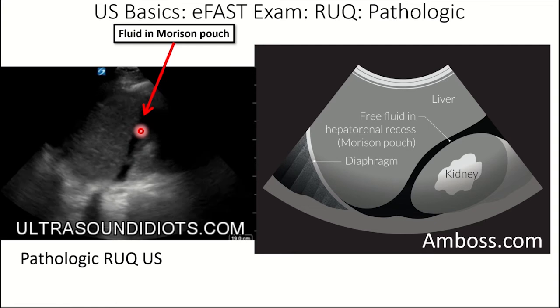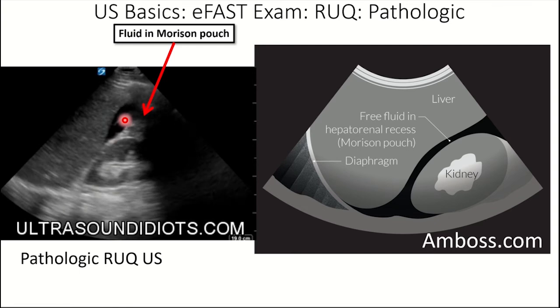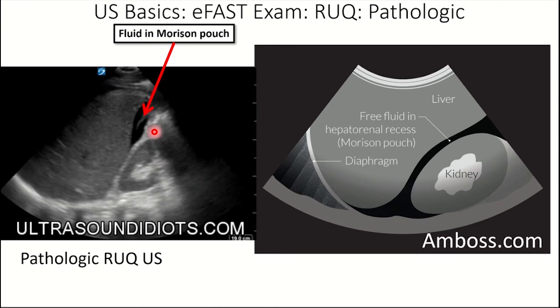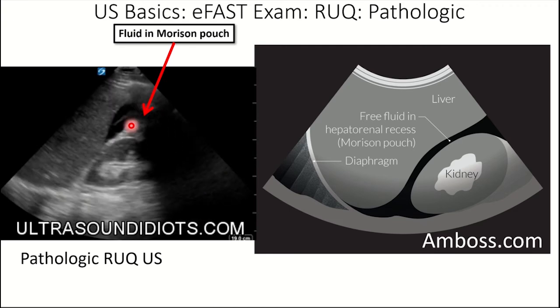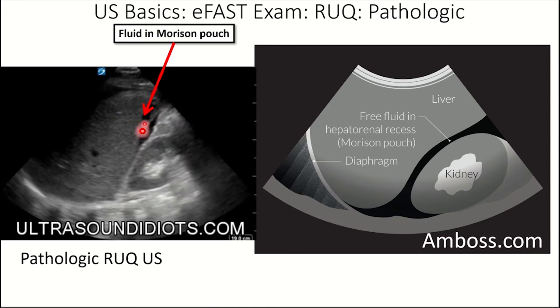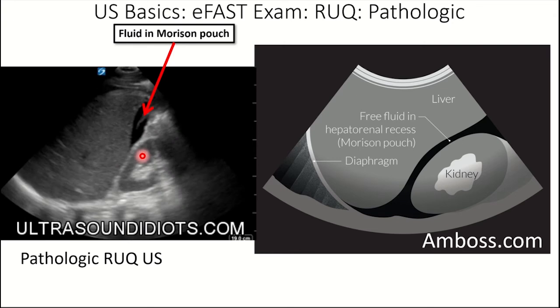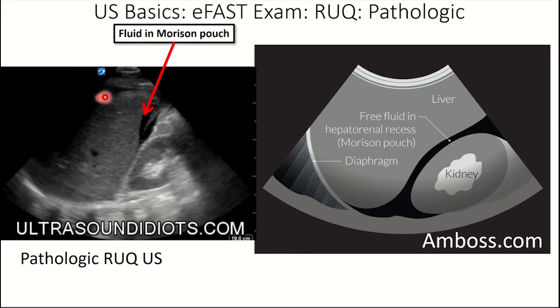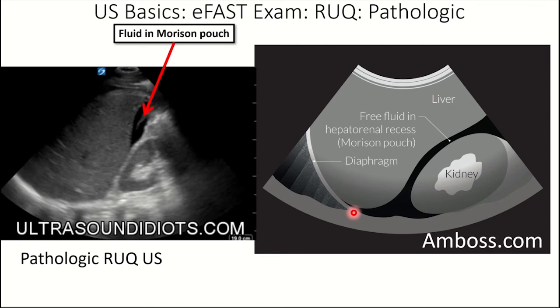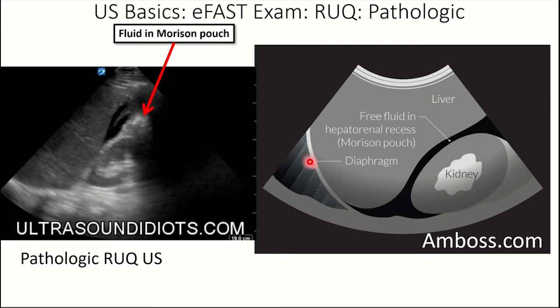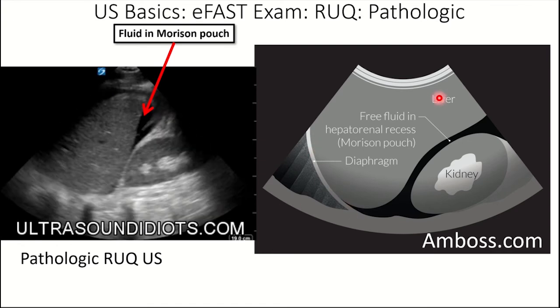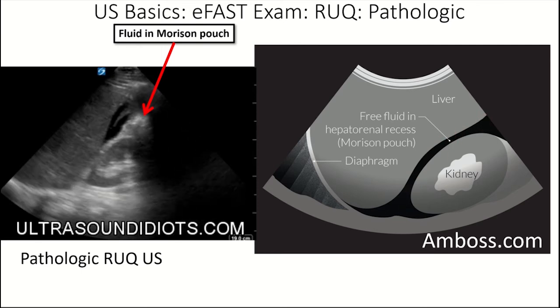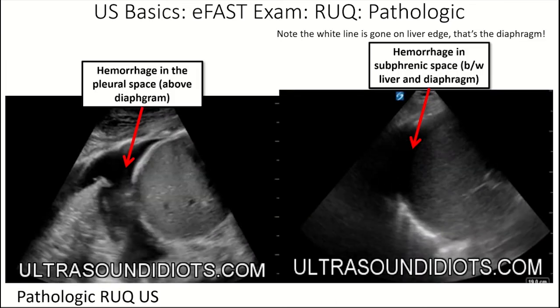Now some abnormal images. Here is fluid in Morrison's pouch — the space between the liver and kidney. We can see a sliver of tissue, likely part of the liver, and that black anechoic fluid is most likely hemorrhage in a trauma patient. There's also some fluid visible in other areas. In the graphical depiction: the diaphragmatic white stripe, the lung, the liver, and free fluid in the hepatorenal recess known as Morrison's pouch.